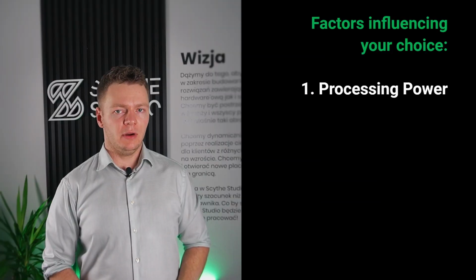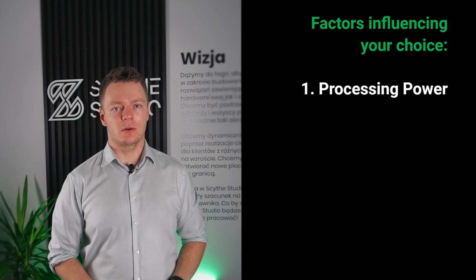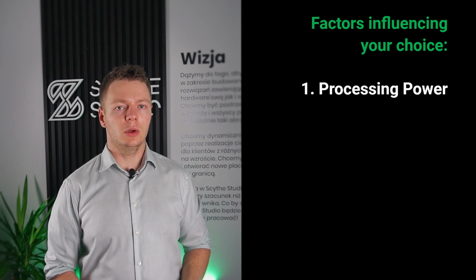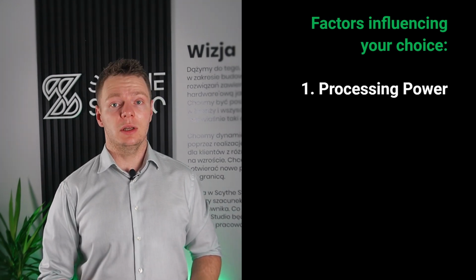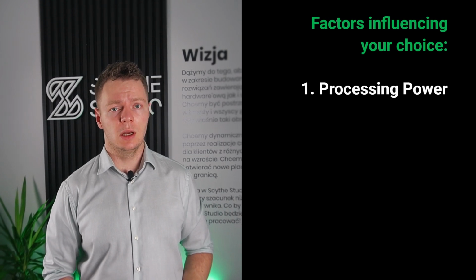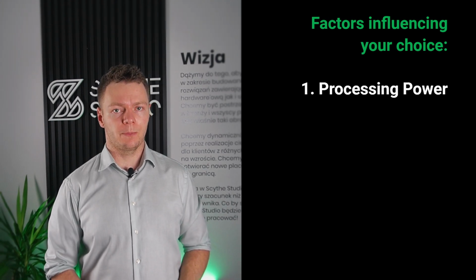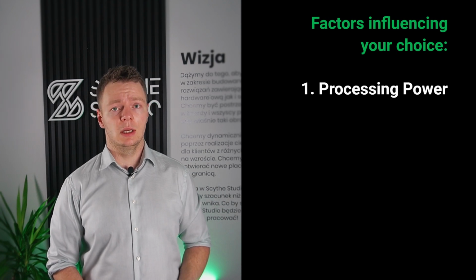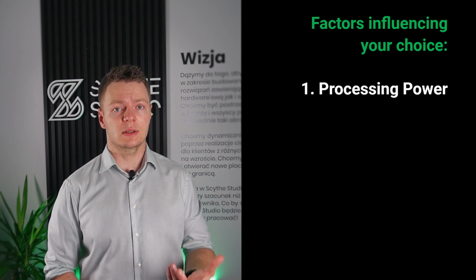There are several key factors to consider when choosing an embedded target for a medical device. Medical devices come in all shapes and sizes, so do their processing requirements. A wearable heart monitor might need an MCU to handle simple tasks, while a complex surgery device could need an MPU to manage advanced computations and nice graphics. The processing power you need will directly influence your choice of embedded target. MPUs typically offer more processing capabilities, but at the cost of increased power consumption and potentially higher cost of the actual device.